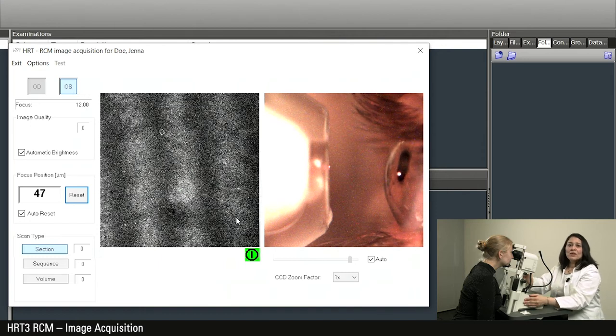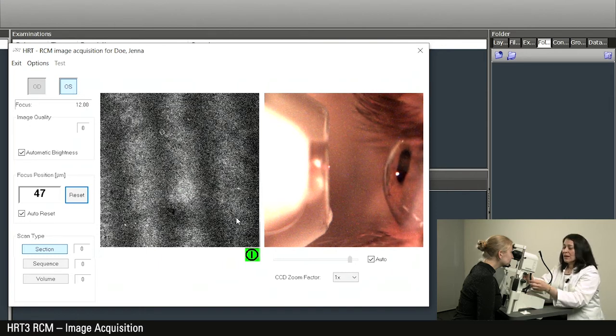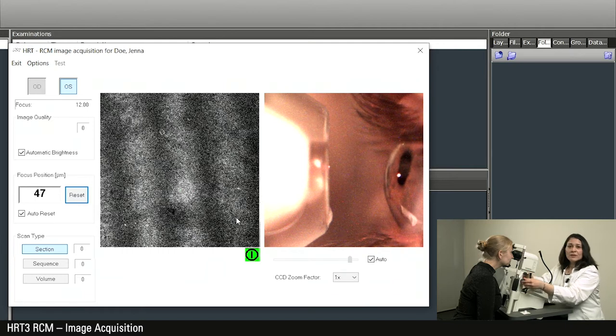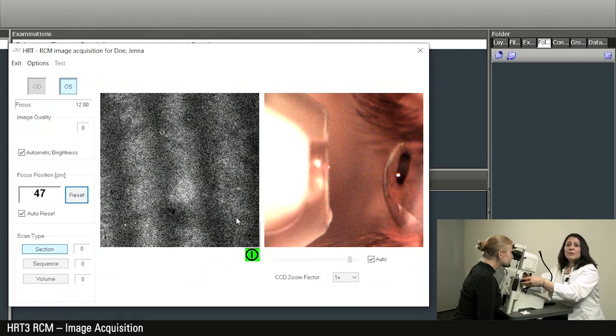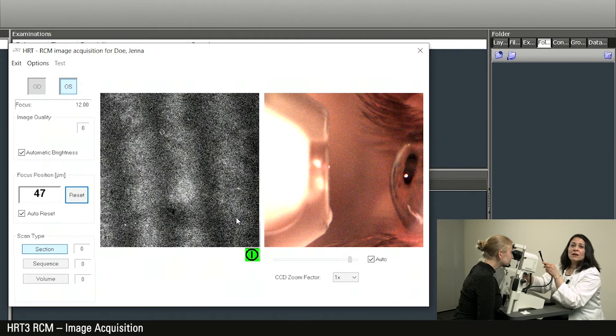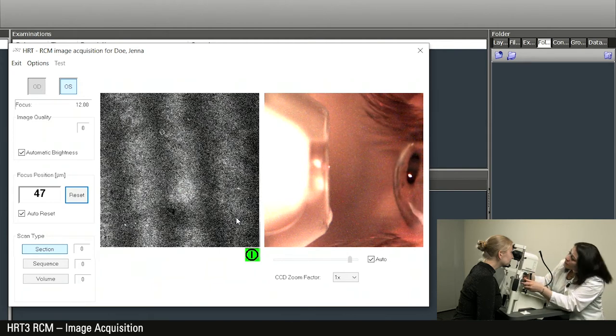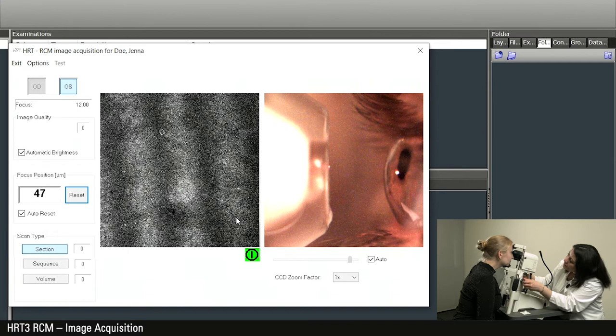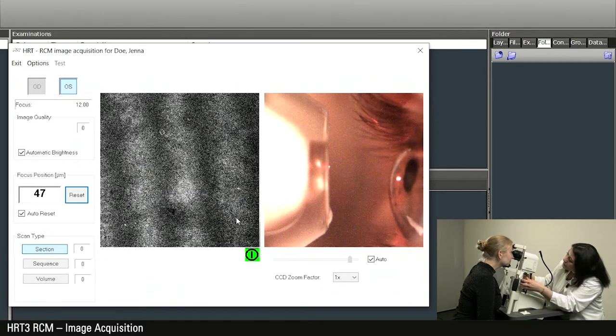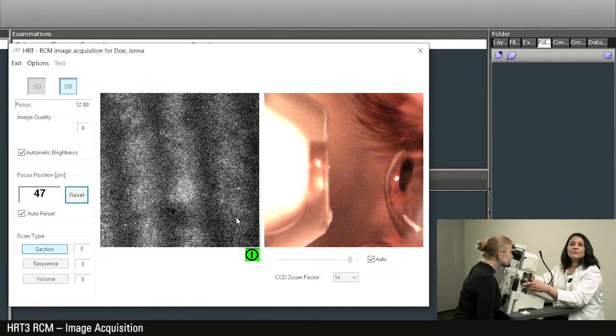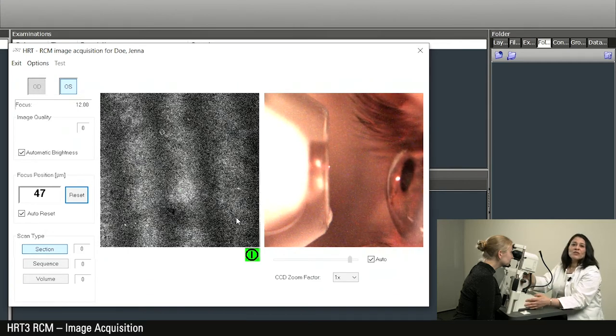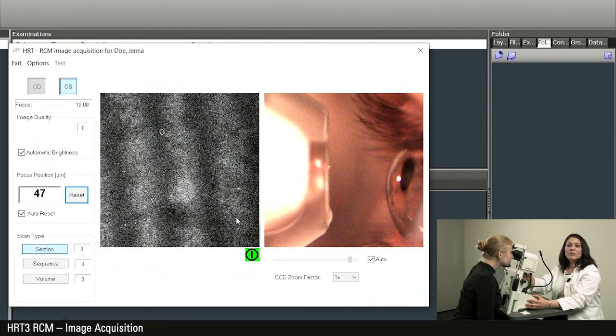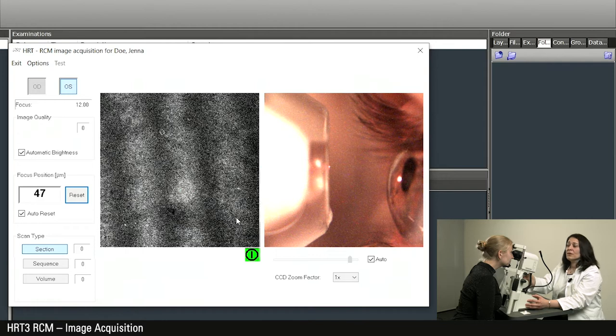Now move the laser scanning camera with the adjustment screws for right and left and up and down such that the red point of the laser beam can be seen exactly on the anterior pole of the cornea. Optimal centering makes the next step much easier and is necessary for good images of the thin layers such as the nerve plexus or the endothelium.